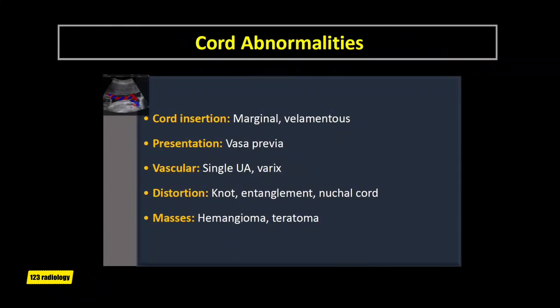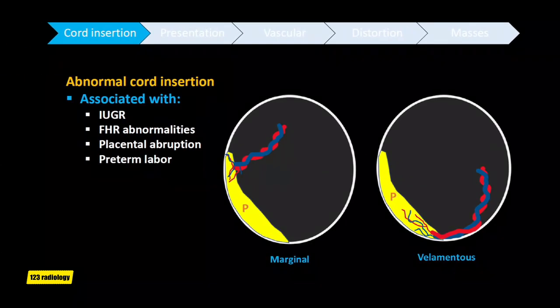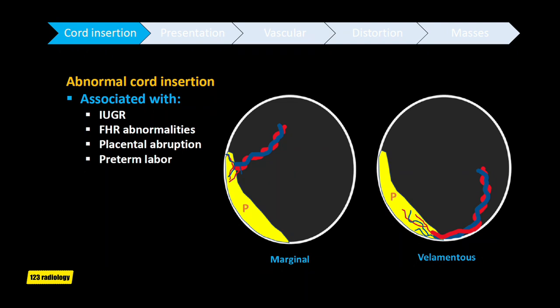A number of abnormalities can affect the umbilical cord, related to its placental insertion, presentation, in utero distortions such as knots and nuchal cord, number of vessels present, and presence of masses. These abnormalities can influence the perinatal outcome and may be associated with other fetal anomalies and aneuploidy. Let's discuss abnormal cord insertion.